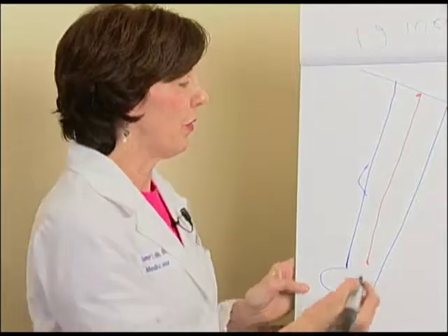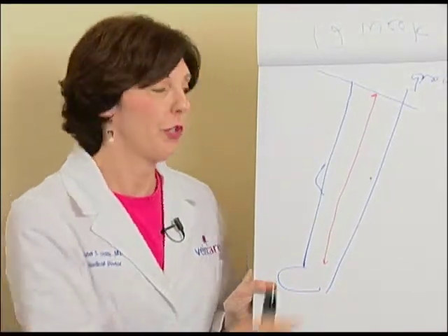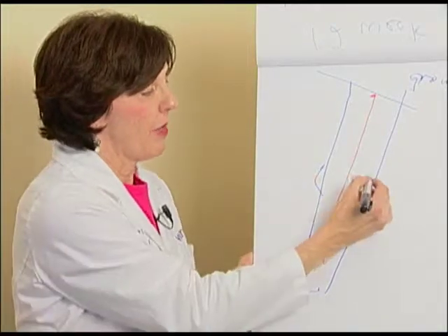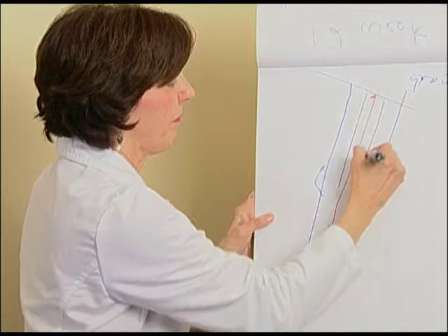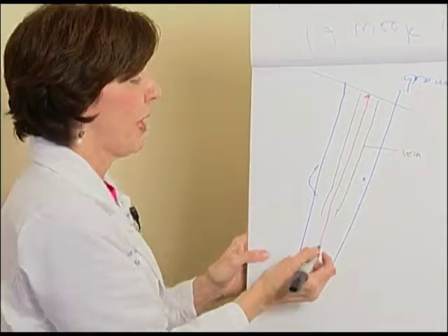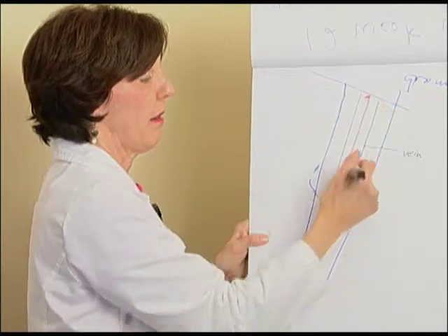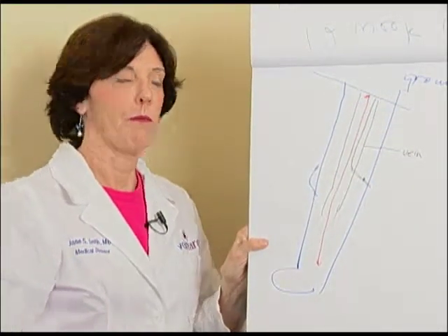Now, what we do is we start out by numbing an area right here, usually the inside of the thigh. You're in our ultrasound room, you're lying on the table, okay? Now, you feel a little bee there. Now, again, here's the vein, and that's the blood going in the reverse direction. What we do is we thread a series of tubes through that area into the vein, on up to the groin where the problem starts, okay?